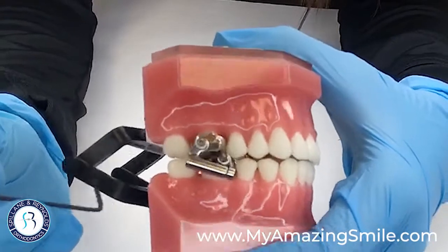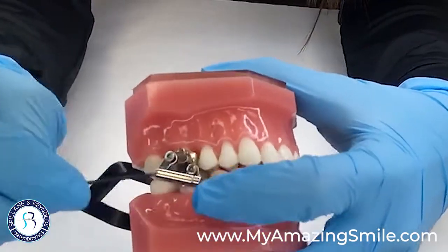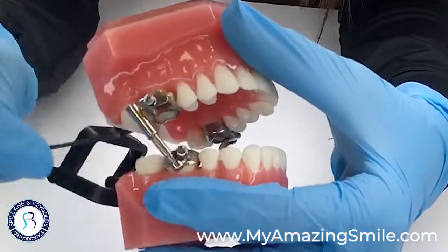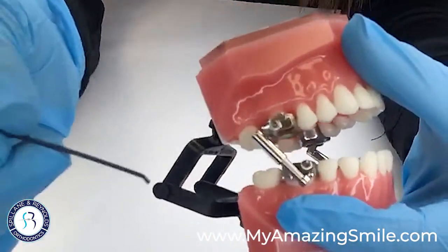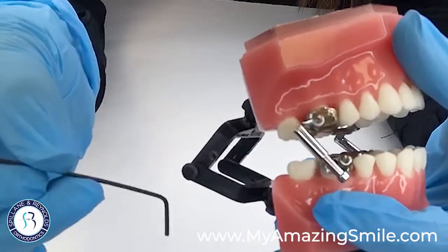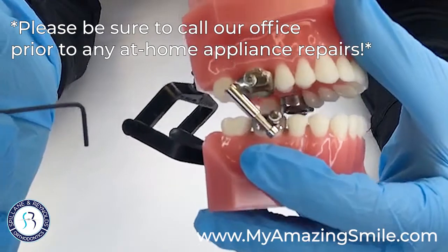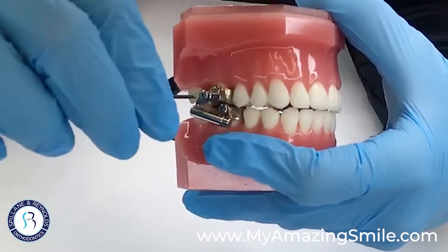Here's our Herbst appliance. Let's say that this lower nut came out, so now this arm mechanism is kind of just dangling — or if the crown came off, whatever it may be — and you need to remove it. We'll put a key in the vestibule area for you, and you can do an at-home fix until we're able to get you in for your comfort visit.